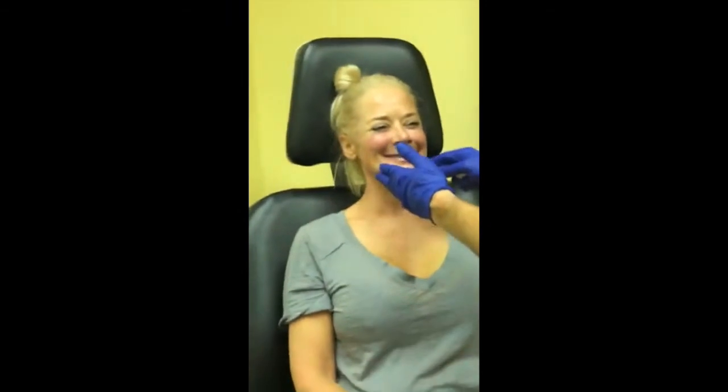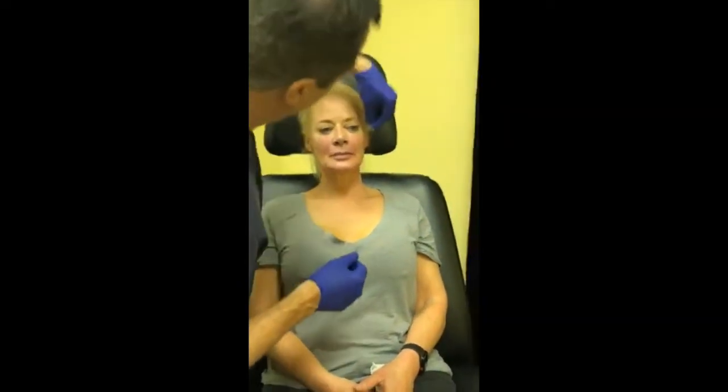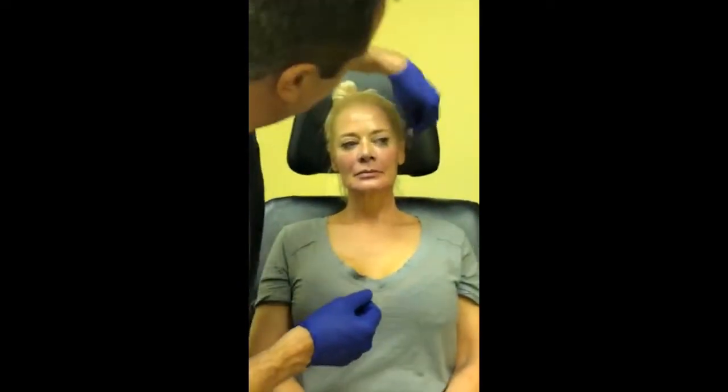Looking really good — let's see where we are. The patient looks in the mirror: 'Oh my god, this looks so much better.' Let me get a little bit just under those crow's feet and then let's do the upper lip. We're going to put very small amounts in these areas — we can always add more, but it's an area with thin skin and not a lot of subcutaneous fat, so we definitely don't want to overshoot.